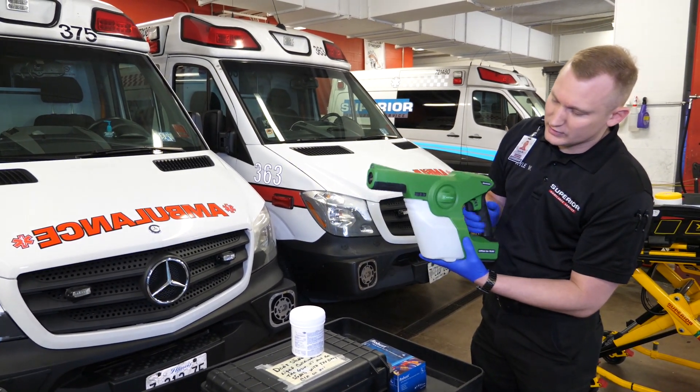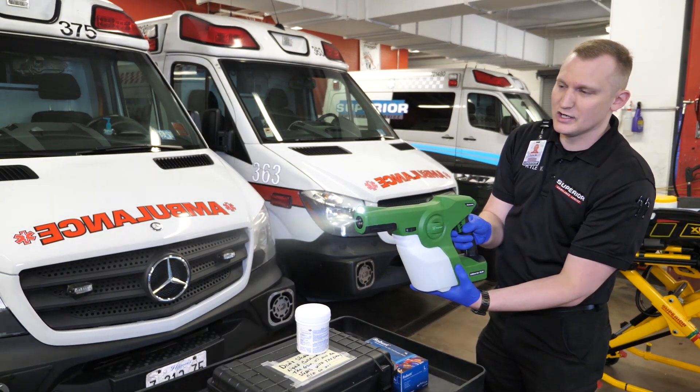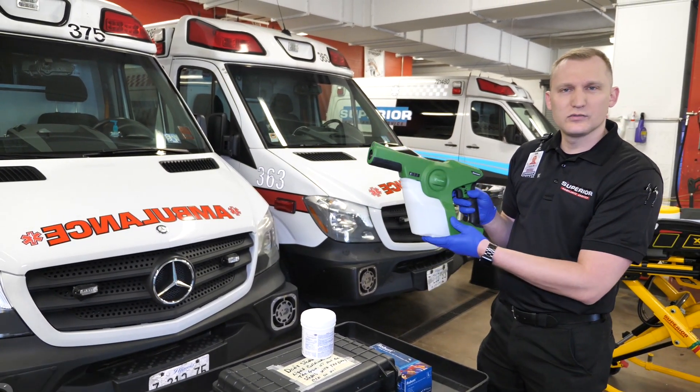We then click the canister back in, re-lock it, and pull the trigger. You should get a nice mist. The sprayer is ready to go.